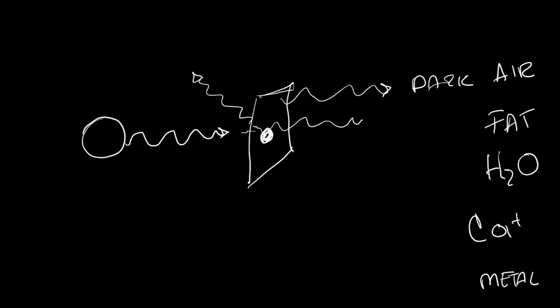And this is the famous grayscale of X-rays. Being white, what we call radio-opaque, like metal, and dark, something that we call radiolucent, like air. Easy, the X-rays cross easily through air, very hard through things like metal.